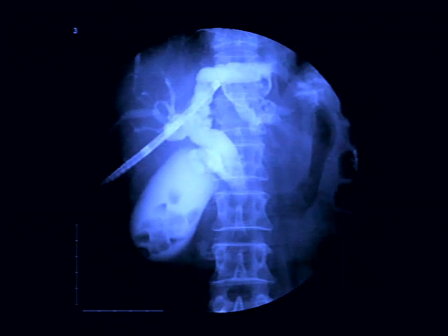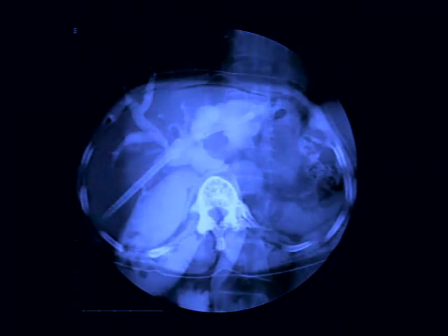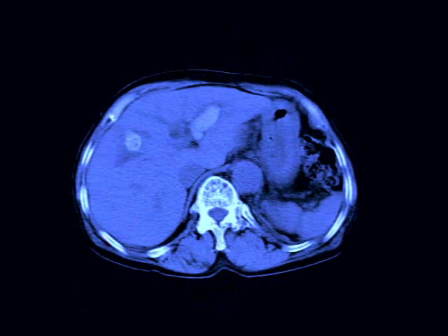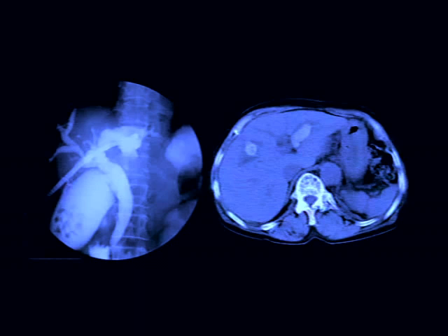This patient shows multiple stones in the left intrahepatic duct and gallbladder. After removal of left intrahepatic stones, this cholangiogram reveals no residual stone in the intrahepatic duct. However, when we review the CT scan of this patient, there are stones in the right anterior segmental duct as well as left intrahepatic duct. Upon previous cholangiography, right anterior segmental duct is missing.